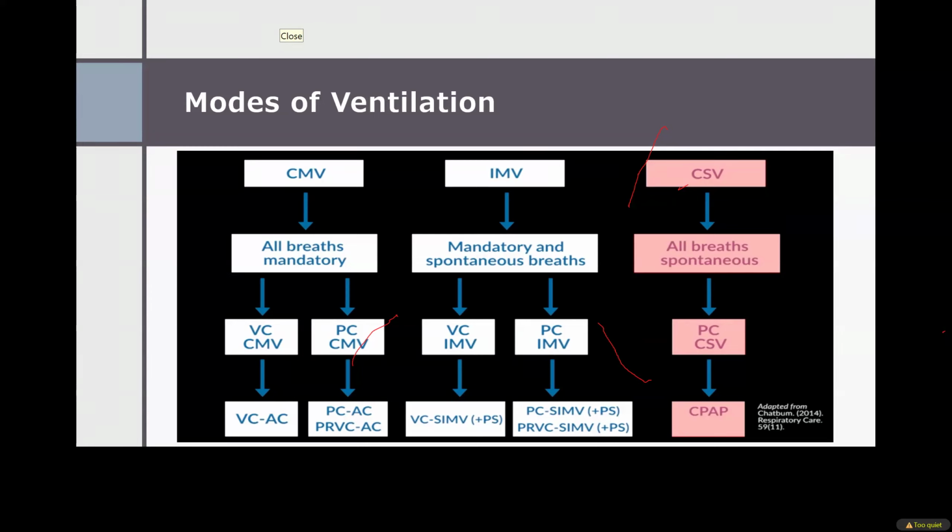Suction should be done only when required and not regularly. Yes, I agree, because suctioning has a lot of adverse effects on the baby. Previously we used to suction them routinely every 4 to 6 hours, and now we suction them as needed. The less you invade the endotracheal tube, the better, because as you're suctioning, you de-recruit the lung. Again, your functional residual capacity goes down. You're also causing vagal responses, secretions, a lot of issues related to suctioning.